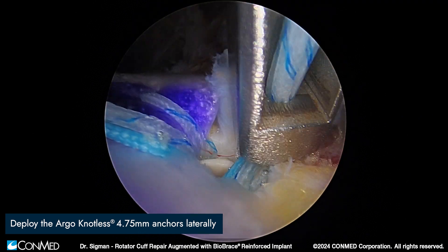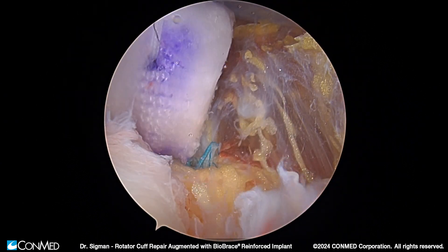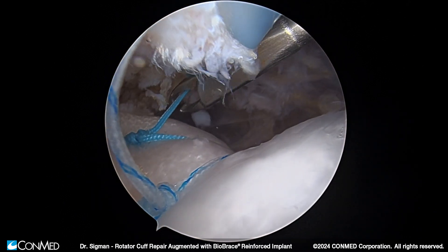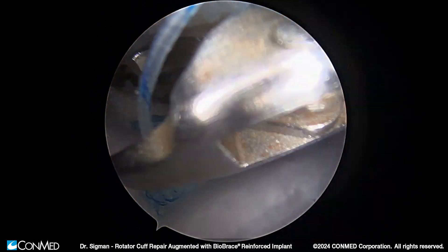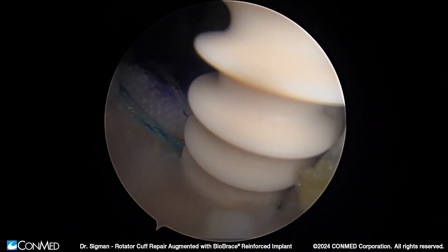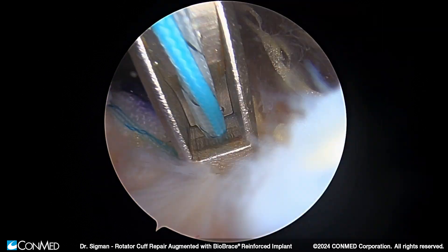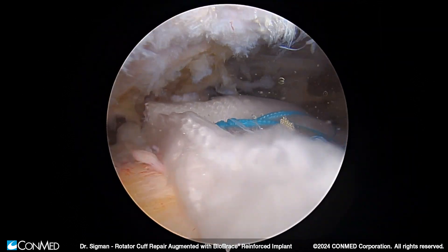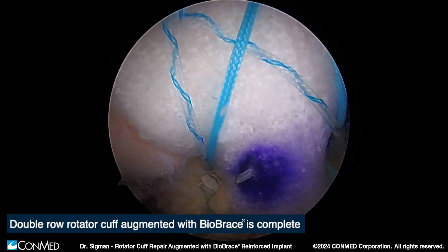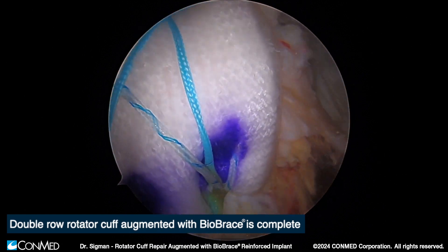You can see here we're placing our Argo 4.75 millimeter anchor with excellent approximation of both the rotator cuff and the implant to the footprint. We grab an anterior medial suture as well as our posterior medial suture to complete our repair, approximating the lateral aspect of the graft down onto the humeral head, creating a standard suture bridge technique. Once sutures are removed, we can see a beautiful spanning across the implant and across the footprint. Transitioning to the lateral portal, we see a very nice rotator cuff repair down to the footprint, with this implant splaying across and augmenting the repair, providing additional time-zero strength and improvement in our rotator cuff construct.